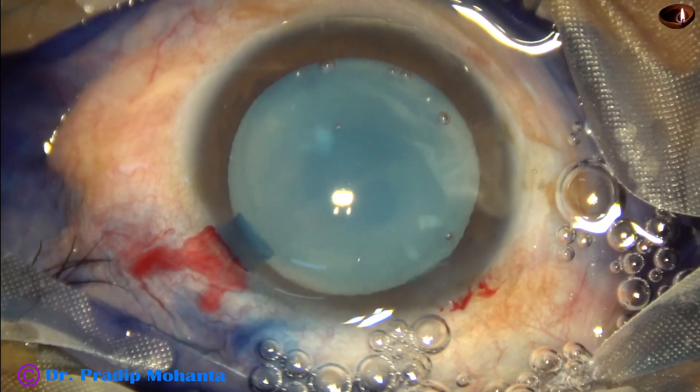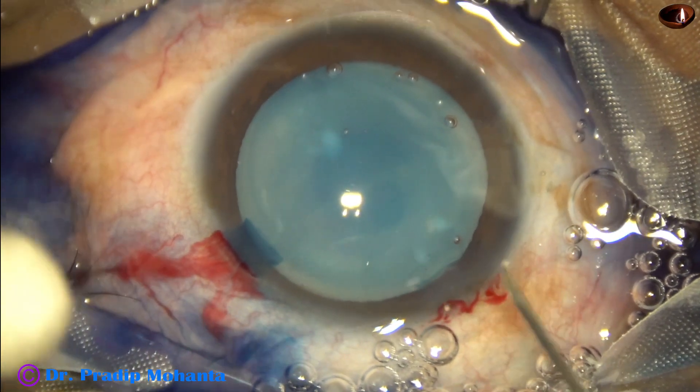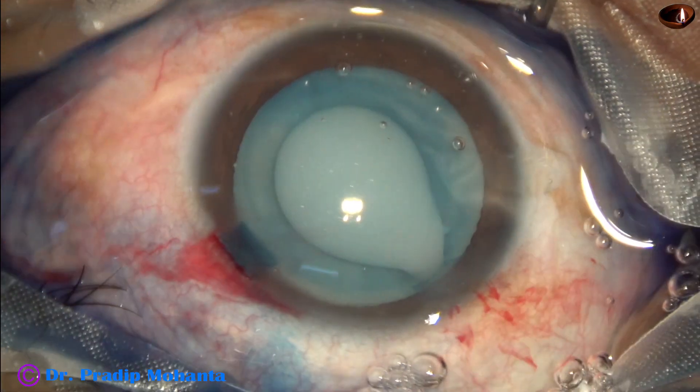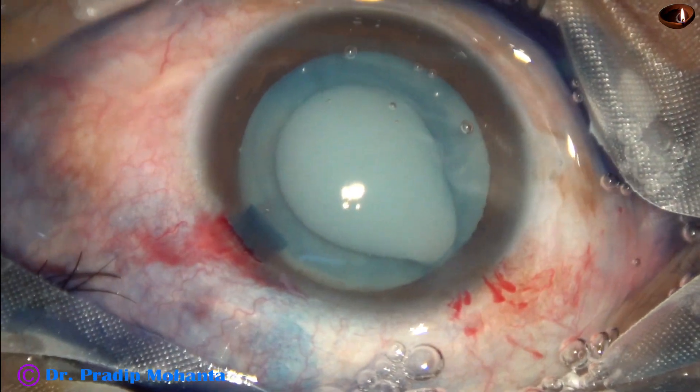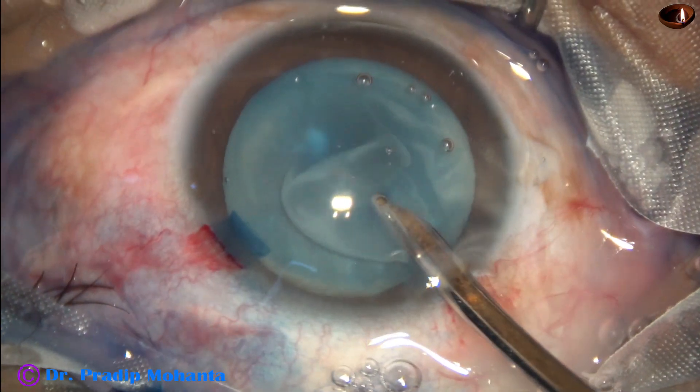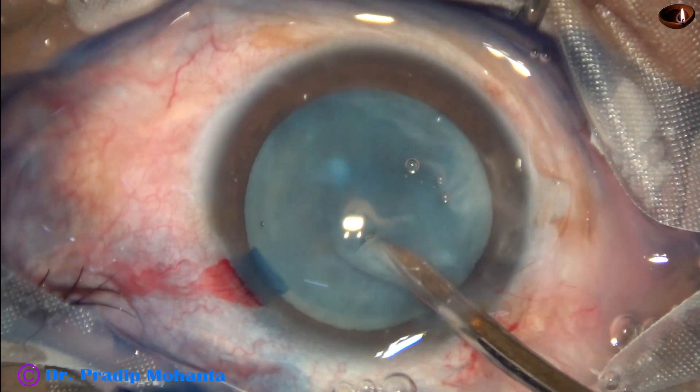The anterior chamber is filled up with two percent hydroxypropyl methylcellulose. With the help of a 26 gauge bent needle cystitome, the anterior capsule is punctured at the center. The milky fluid is aspirated.